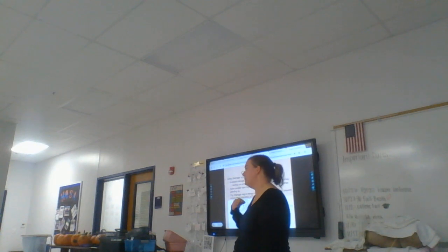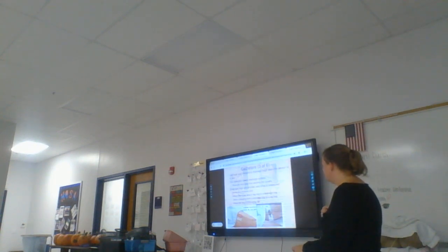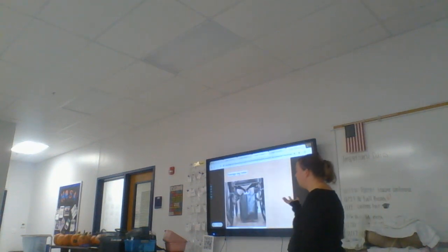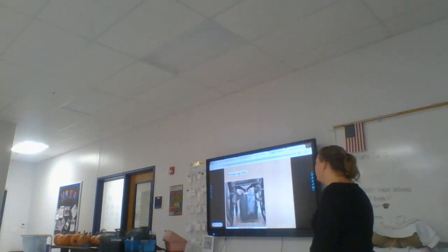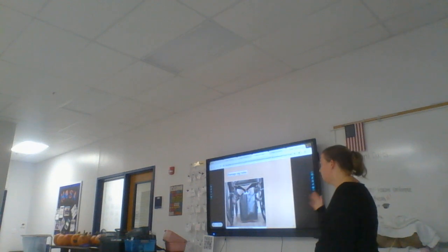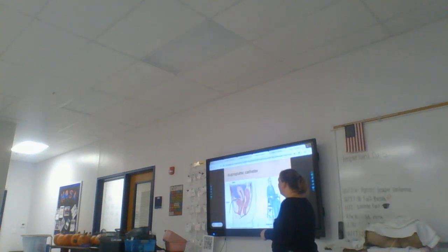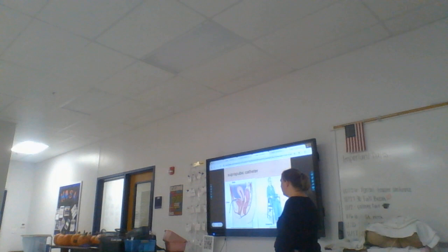And coming up is going to be a picture of a wheelchair. Oh, let me see here. Oh, it's a ways off. Oh, there it is. A wheelchair drainage bag holder. Not all places have this. A lot of times you just have to hook it on the side and go. But some facilities, especially for patients who are using the catheters a lot, are going to have this kind of self-esteem holder that hides the catheter bag. Okay? So make sure that you keep that catheter bag lower than the bladder at all times.